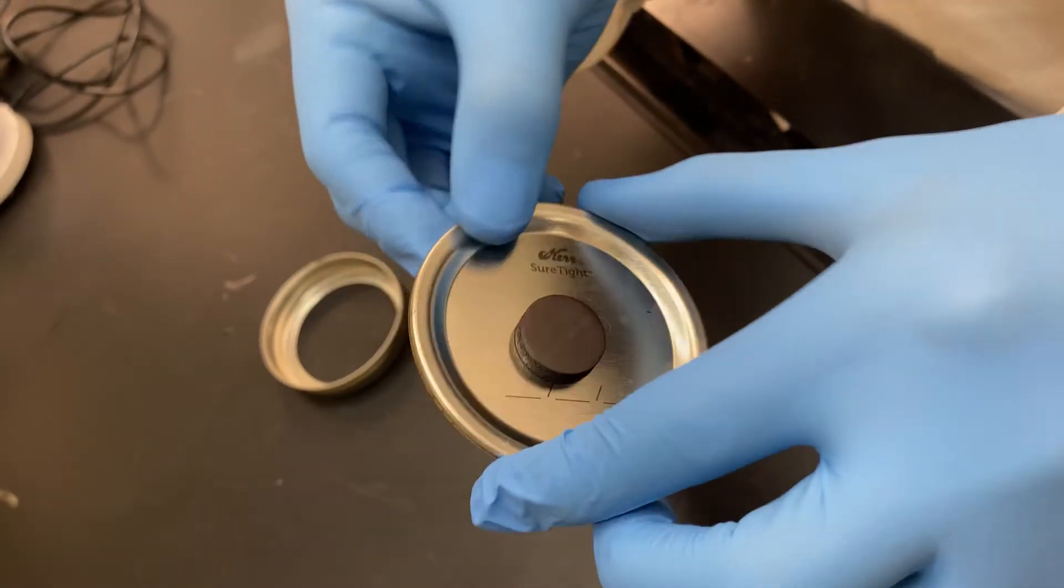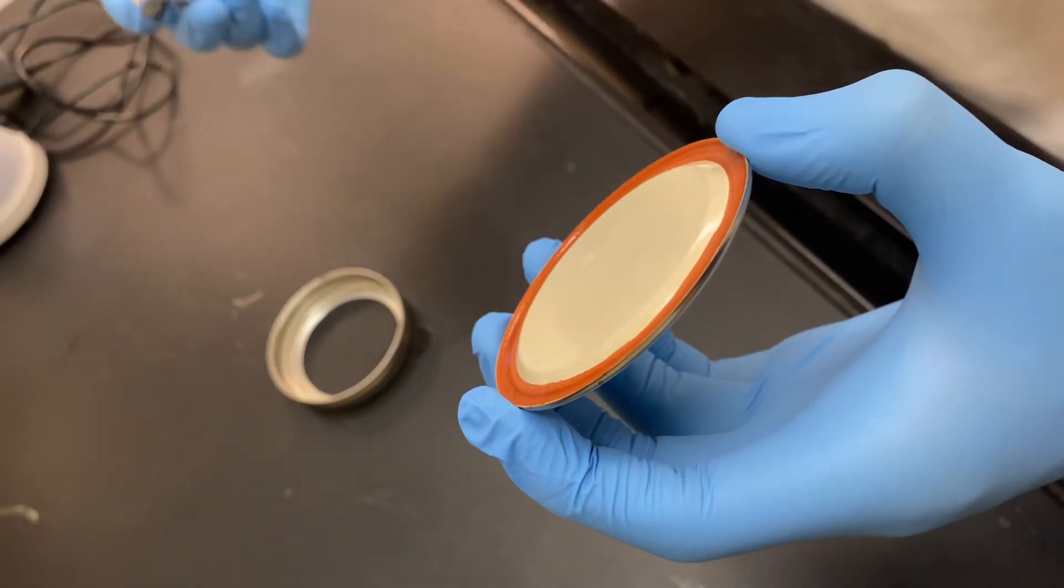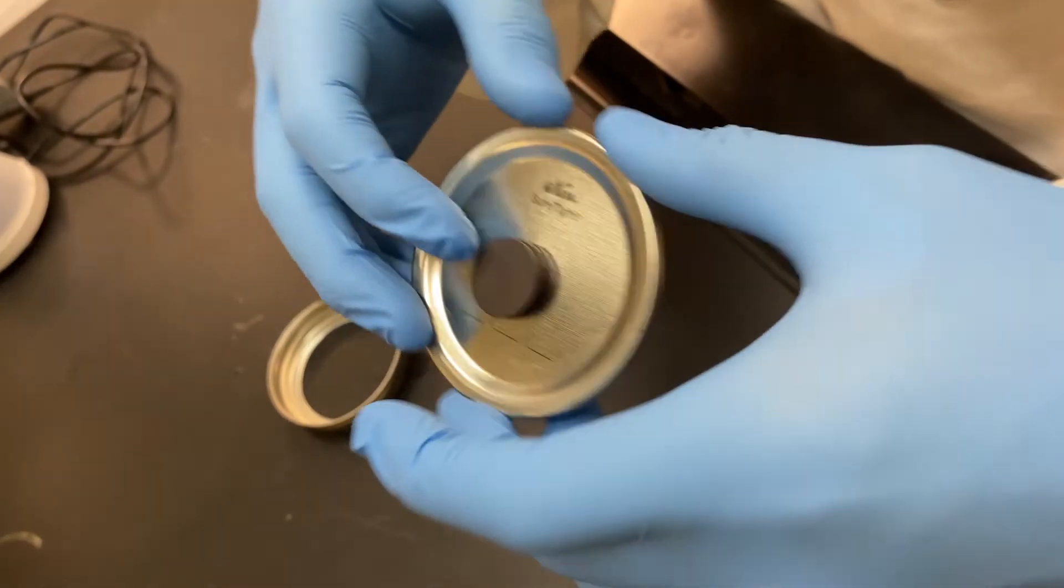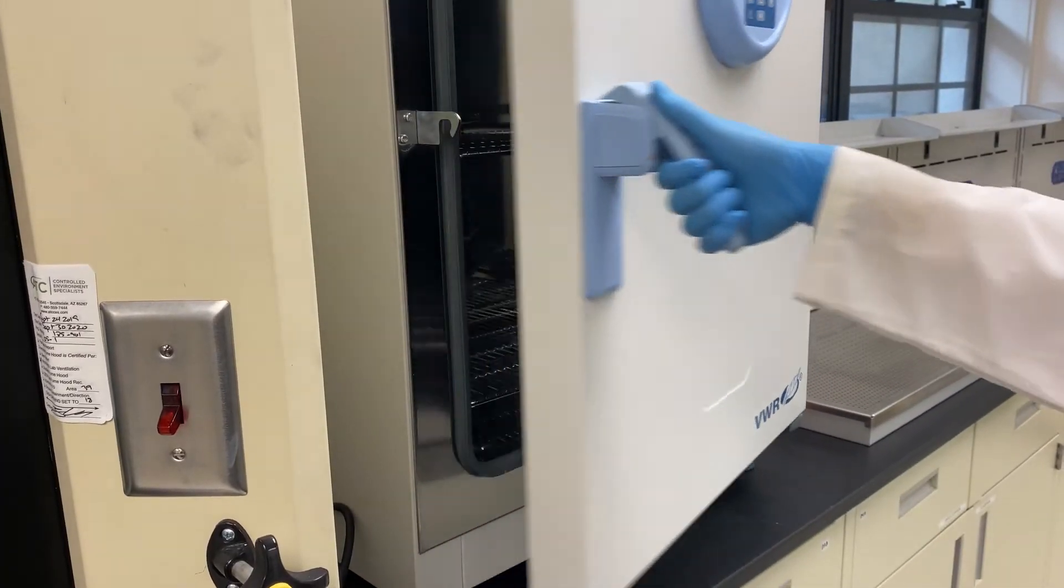In a fume hood, fix the safety pin to the lid of the mason jar by placing the magnet on the outside of the lid and the pin on the inside. The pin should be lengthwise across the magnet.